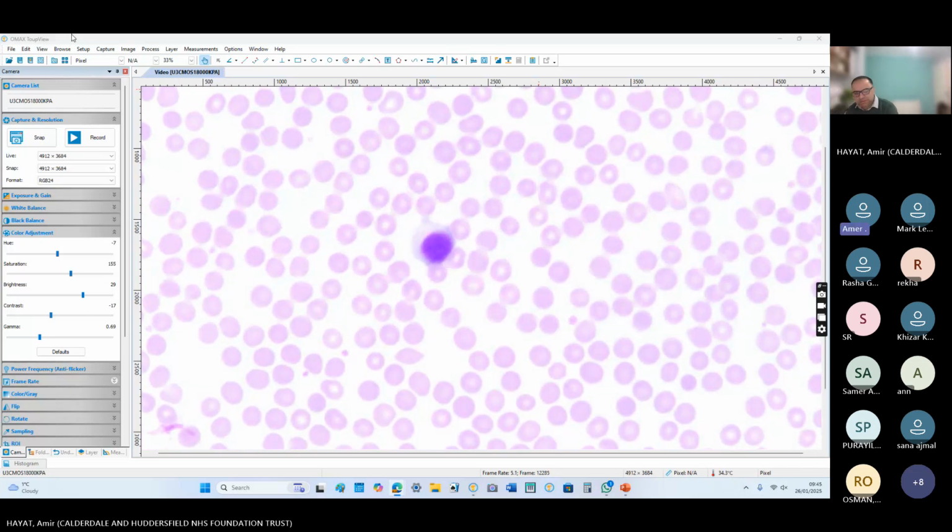Always concentrate on the history. A 20-year-old cannot have a CLL, and follicular lymphoma has its own morphology. Mantle cell lymphoma has its own morphology. Waldenstrom cells or marginal zone lymphoma has its own morphology as well. They are not like these large cells with basophilic cytoplasm, and there is prominent scalloping. This cell is scalloping to 4 RBC, you know.